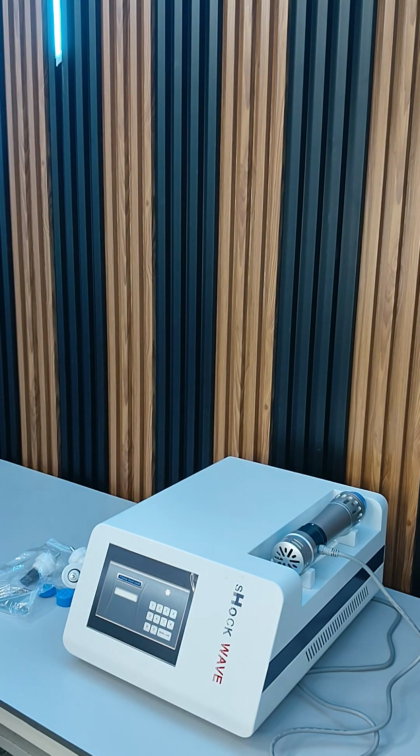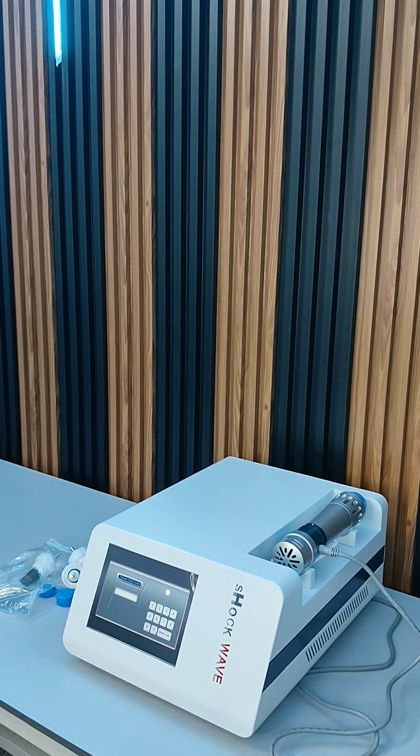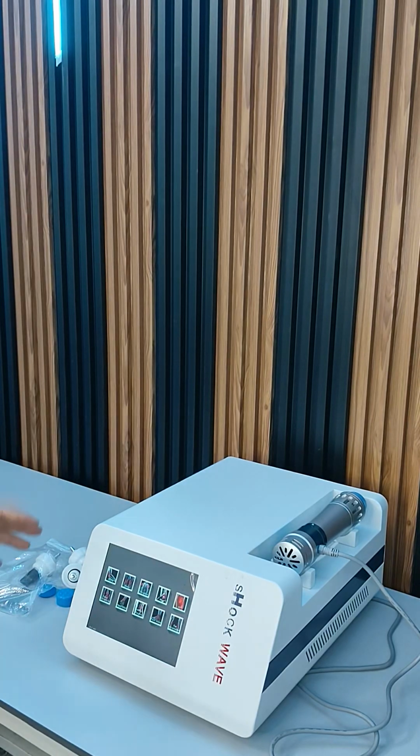0 0 0 0 0 0, 6 times 0. You can modify it also, and that password you will share with the person whom you authorize for using the device. You can put the default 0 0 0 0 0 0. As soon as I put 6 times 0, the default password, I will enter the main interface.